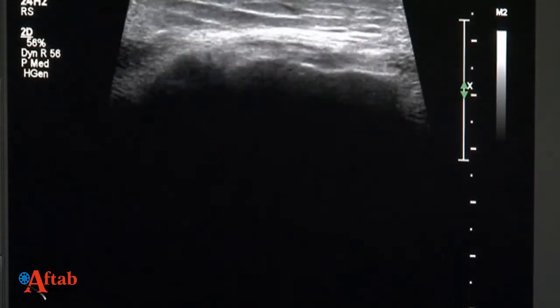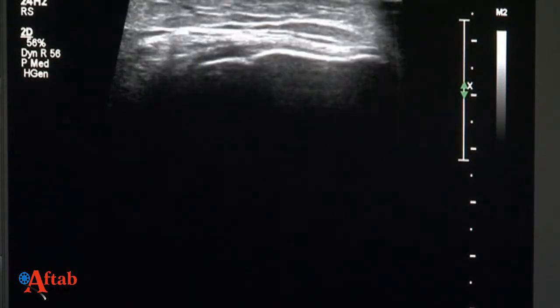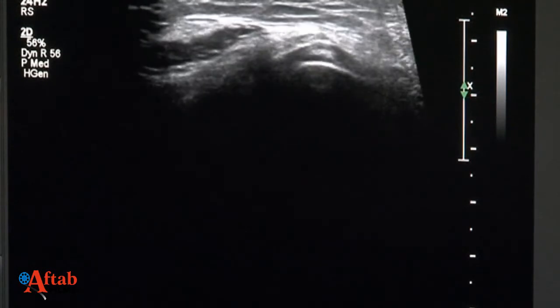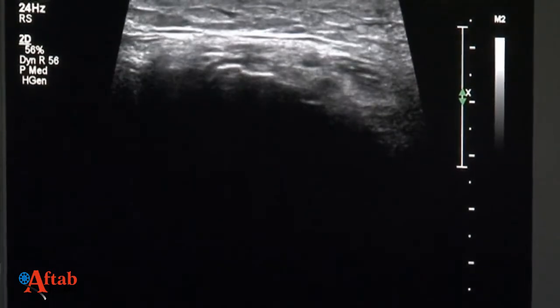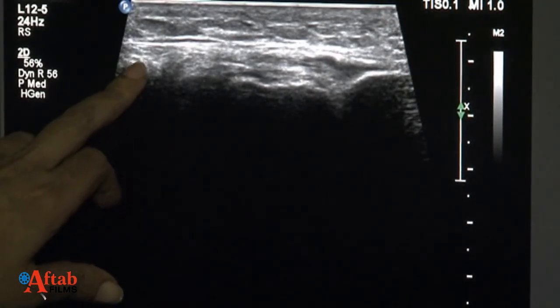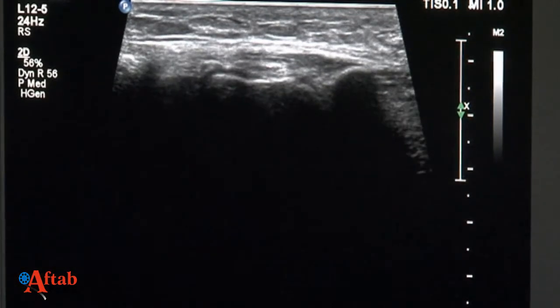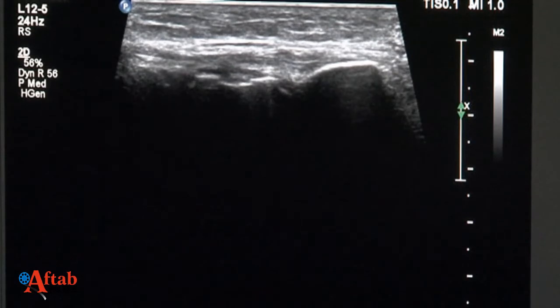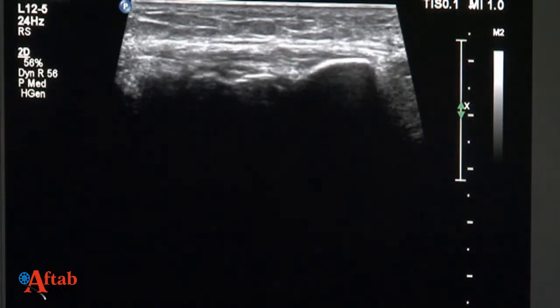We come to the joint line, and against the joint line, what we are seeing here is the proximal region of the femoral condyle. We have the tibial condyle, and then we have the head of the fibula. What we see in the middle is the proximal tibiofibular joint, and he gave a point tenderness at this level. There appears to be a little bit of a loss of the fibrillar pattern of the attachment of the lateral collateral ligament, but now he is comfortable.